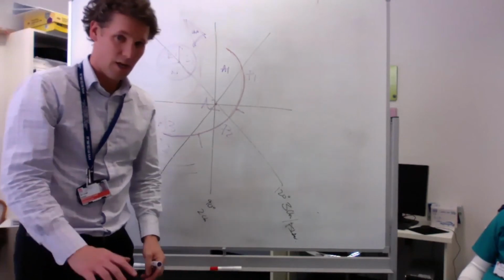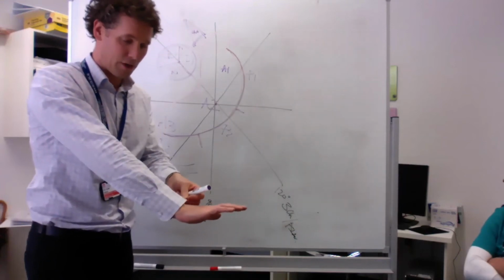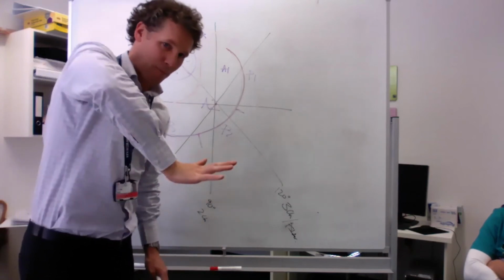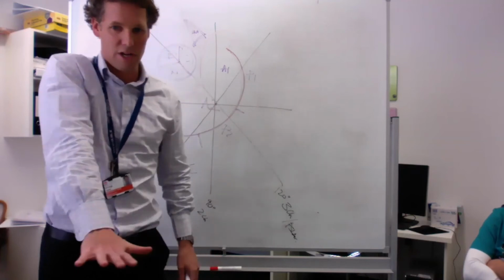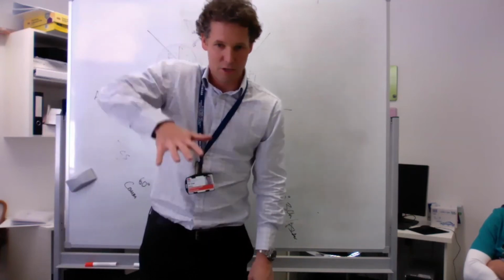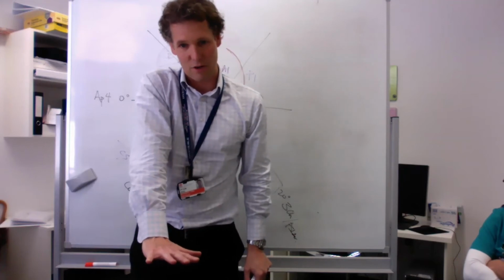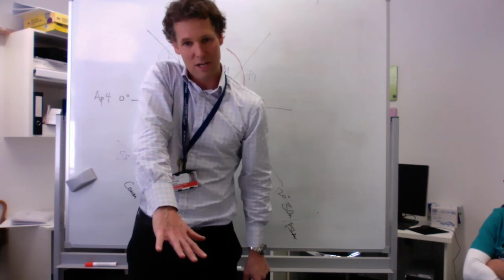So when I talk about in TOE, if my shirt is the TOE probe, my patient's facing away from me and sort of sitting down, and I'm putting the TOE probe down like that. My thumb is at 0 degrees, so maybe I'll do it like this, might be better. That's going down their throat with them facing away from me, and that's 0 degrees. I have a little bit angled back, so I'm looking down at their heart.